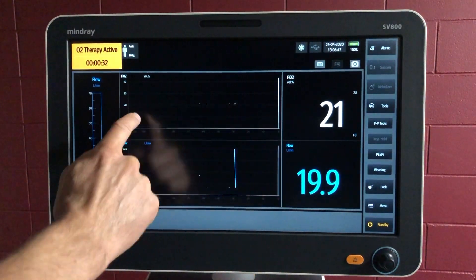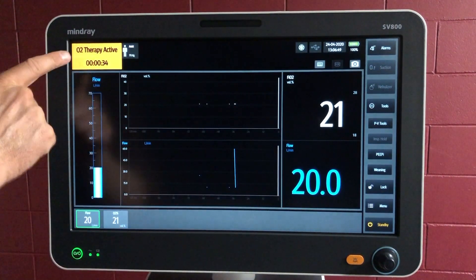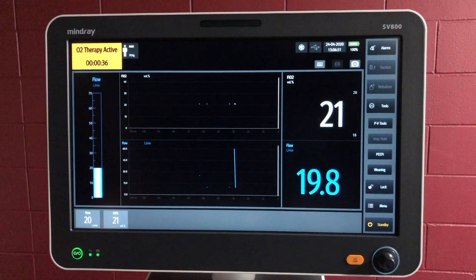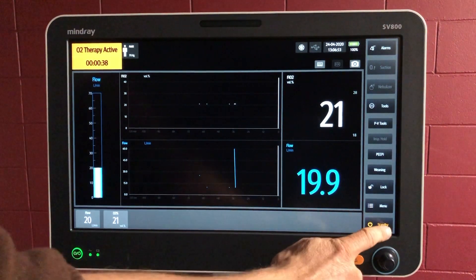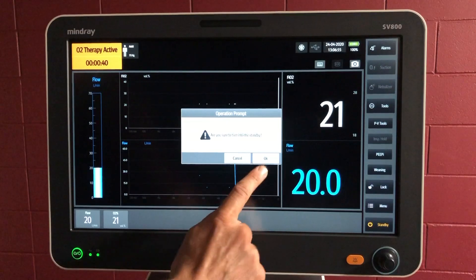We've got a history as well with that and a timer. So that's the oxygen therapy. To go off that, you can go back onto standby.